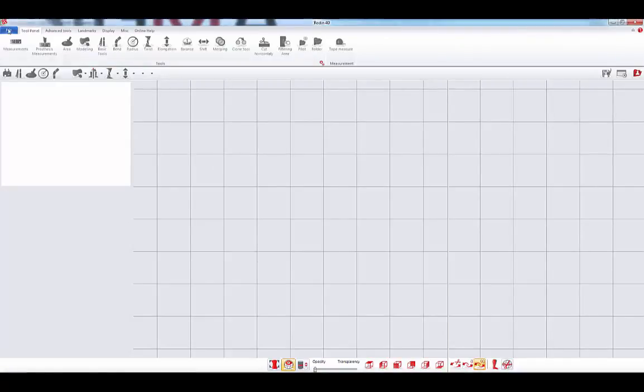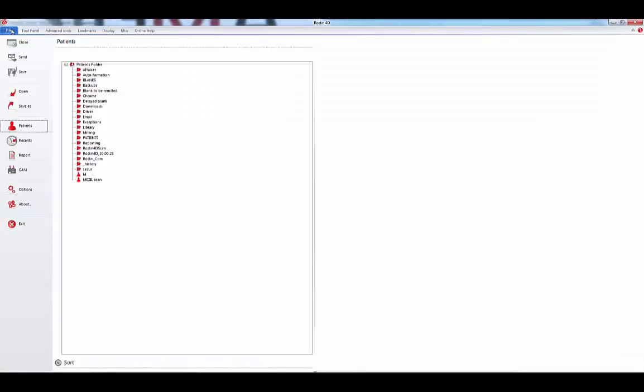The first tab of the ribbon menu is the file tab. It gathers every general function of Rodin. You can for example see the list of your patients.